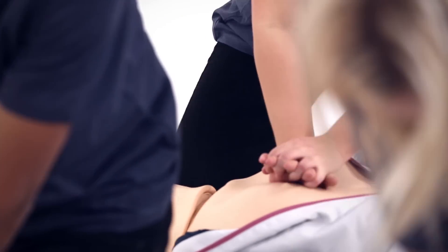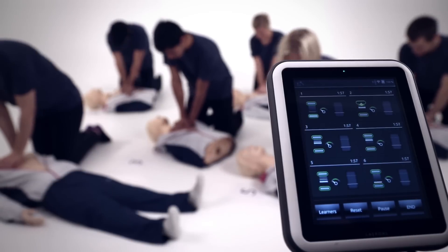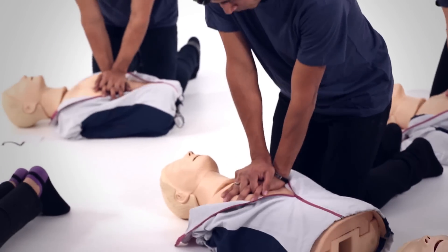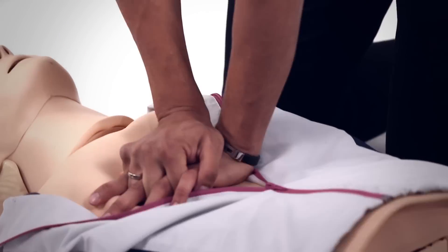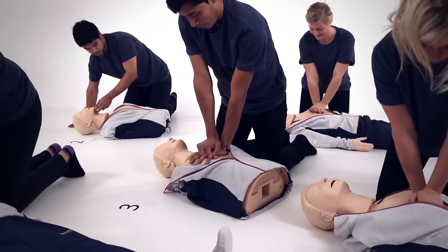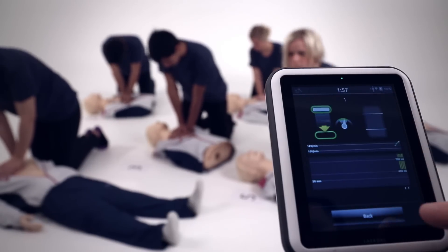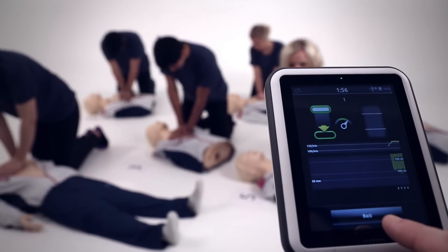Sympad's Skill Reporter can be used with up to six Reisussian QCPR manikins, ideal for training in a classroom setting. Select the manikin you want to see the full details of the CPR performed.